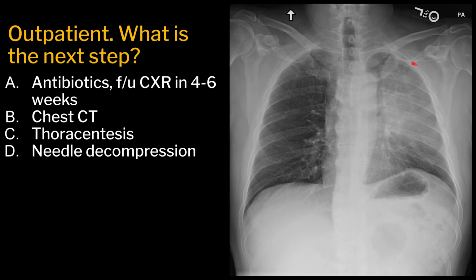Okay, let's return to question one. We have a patient who has a frontal chest radiograph with an abnormal hazy opacity in the left hemithorax, as well as decreased volume on the left side, manifest by an elevation of the left hemidiaphragm. We have ribs that are close together and also what's called a juxtaphrenic peak on this side. Also notably, we have a lucency between the aortic arch and this opacity. These are all signs of left upper lobe collapse.